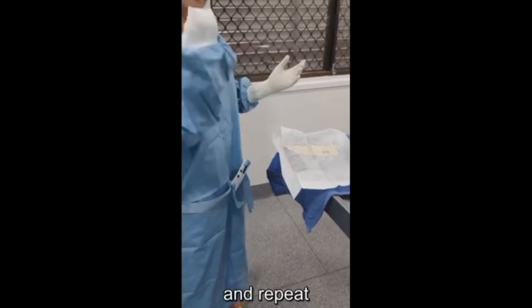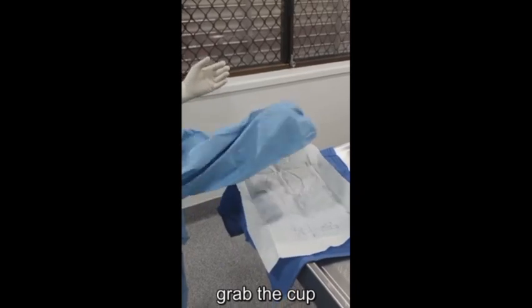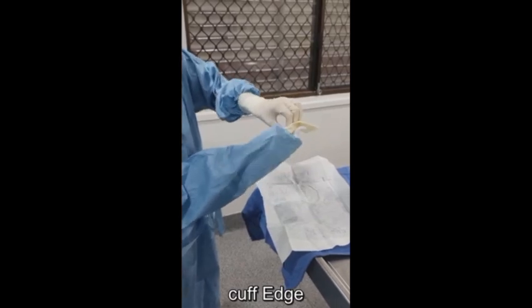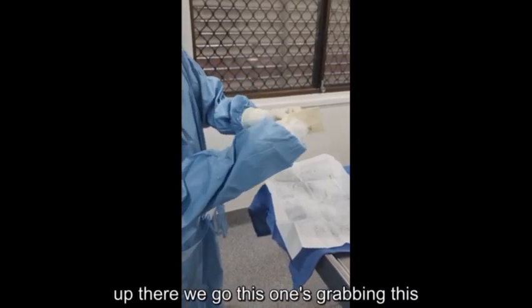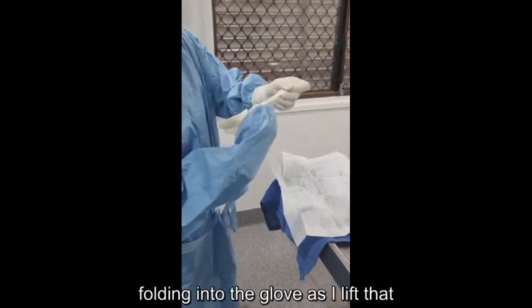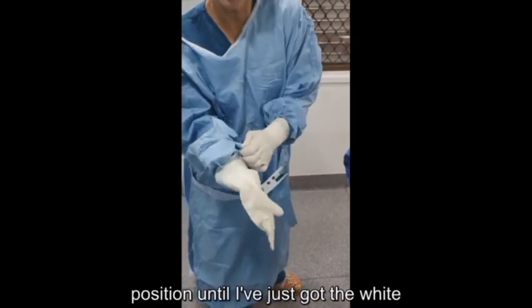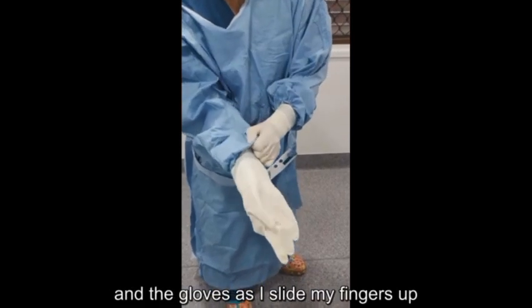Then repeat. Muppet hand, grab the cuff, flip over, fingers are facing towards you. This hand now comes in and grabs that cuff edge. These are a bit sticky, so we'll just fiddle around to loosen it up. There we go. So this one's grabbing this cuff, this is grabbing that cuff. These fingers are folding into the glove as I lift that cuff over the top. Position until I've just got the white cuff covered and I'm grabbing the gown and the gloves as I slide my fingers up.